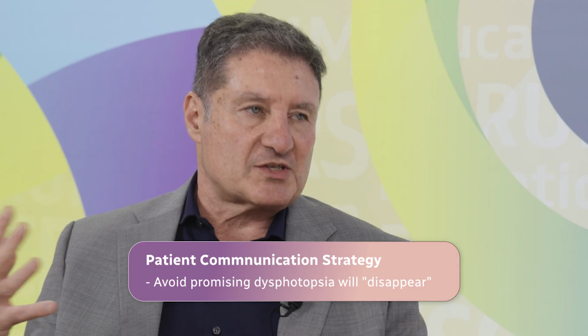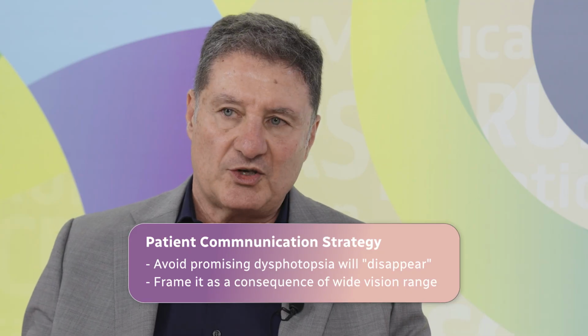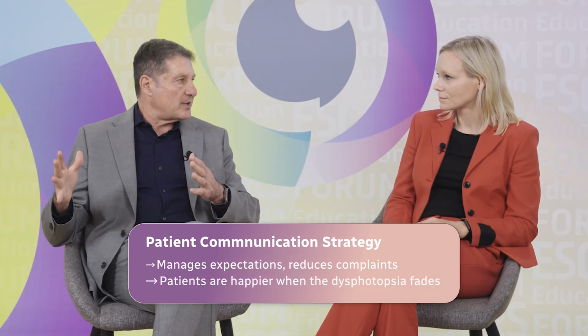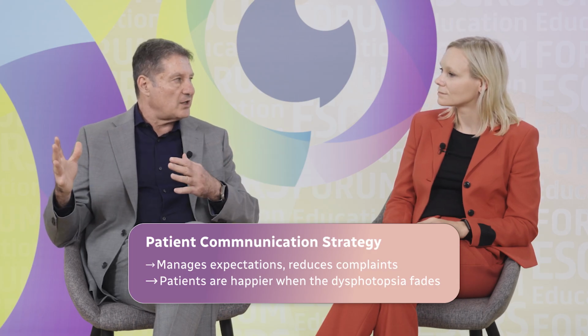Yeah, I almost stopped talking about neuroadaptation and telling the patients you will see this photopsia decrease and eventually disappear. I really do prefer telling them, well, this is the consequence of this wide range of vision that we are going to provide you. And patients basically stop complaining because they do not have an expectation. And guess what? When this neuroadaptation actually happens and the halos and the night dysphotopsia fade away, they are even happier.